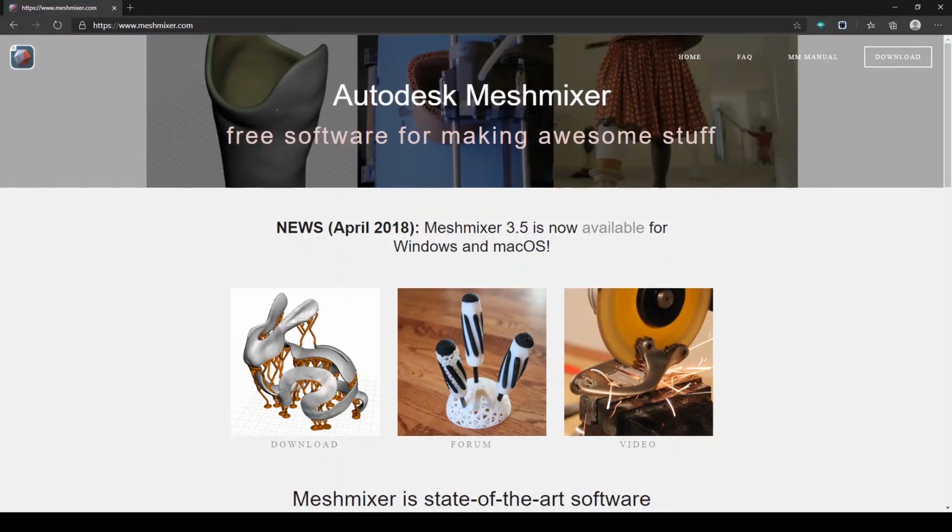Good day, everyone. Today we're going to learn about using the software called Autodesk Meshmixer. It is a free software for making and manipulating 3D files or 3D objects. Whether you need to clean up a 3D scan and do some 3D printing or designing an object, Meshmixer is widely known to be used for those purposes.